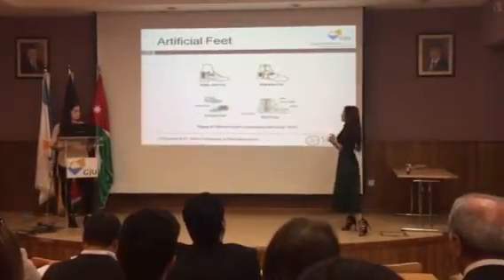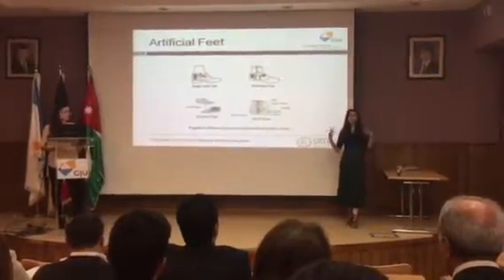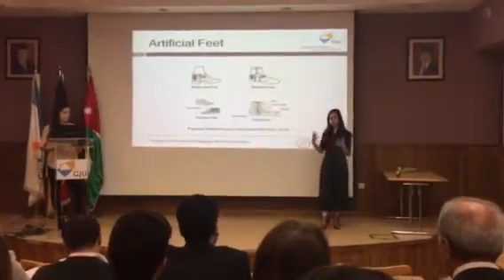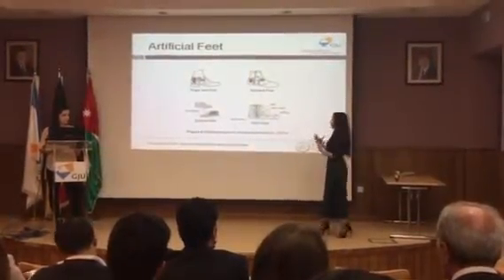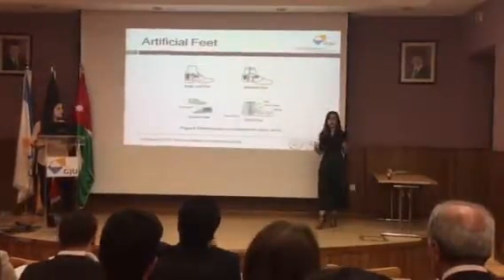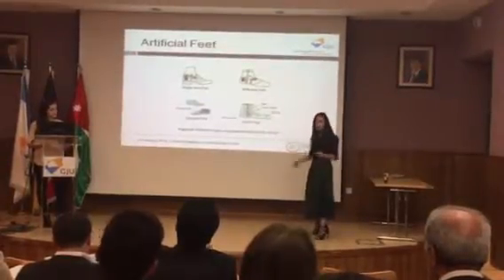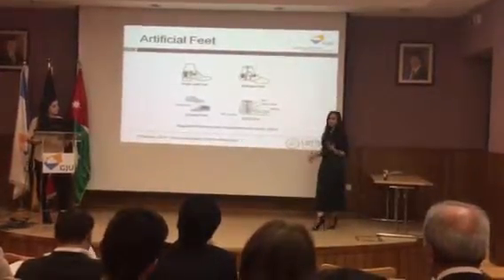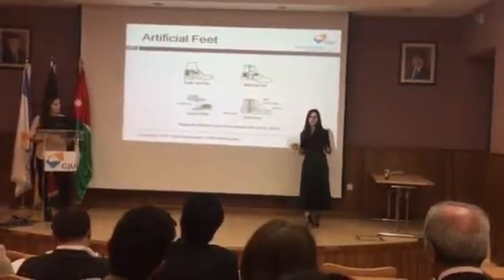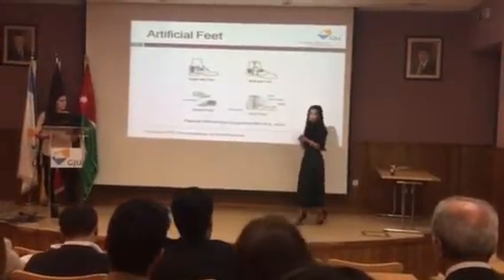And we have the third foot, which is a dynamic foot. This type of foot is considered the most responsive kind of foot. It's intended for users who require a very active foot that not only works efficiently in the way it moves, but also has a good energy return. As you're walking using the dynamic foot, it absorbs energy generated through the gait cycle, as a human foot does, and returns some of that energy, so it's energy efficient.